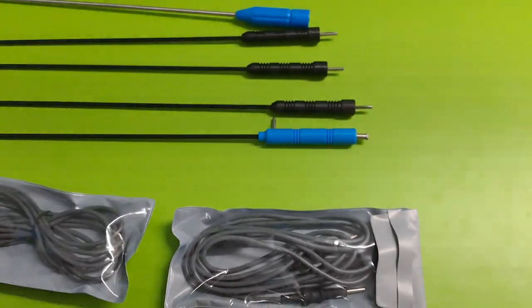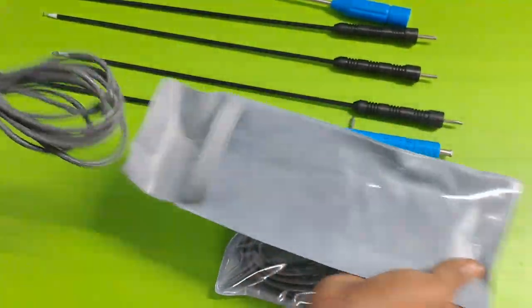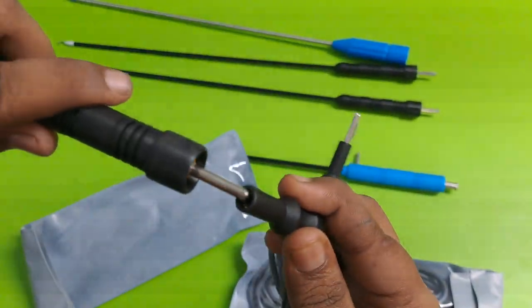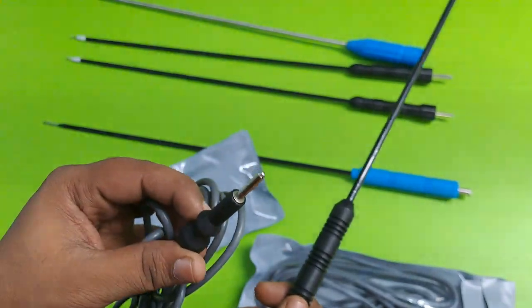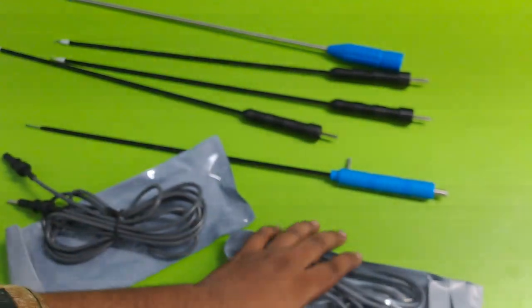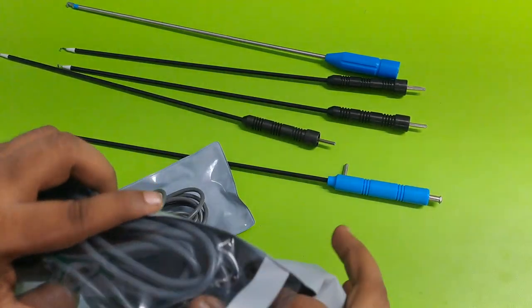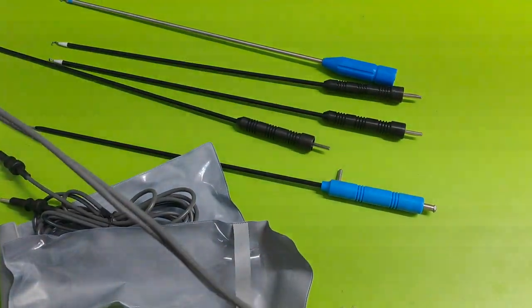Now I am showing you the Monopolar Cable and Bipolar Cable. This is the Silicon Monopolar Cable — easily attach here. This pin goes into the cautery machine. And this is the G-hook. Another one is the Bipolar Cable — also pure silicon material.